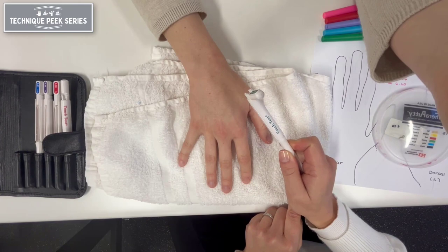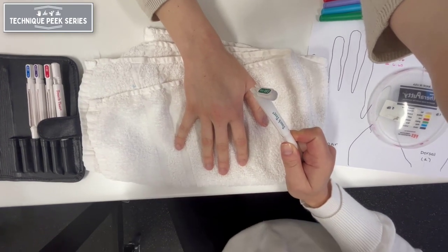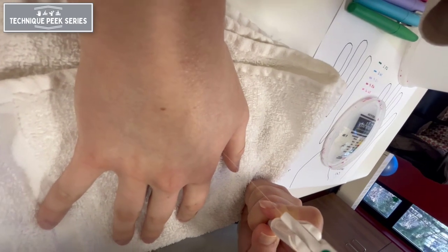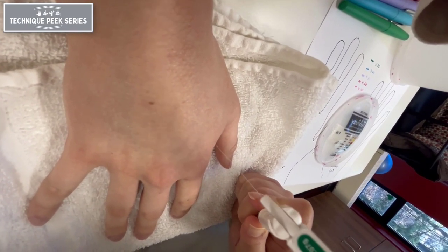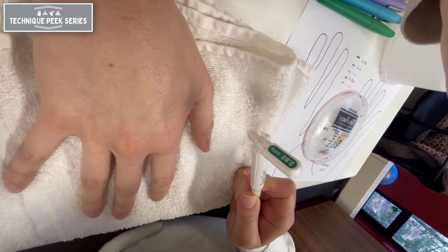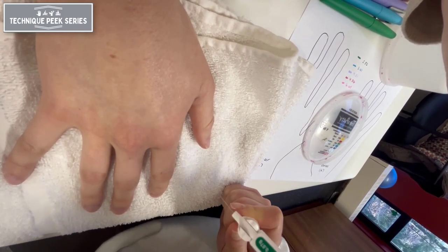It is not necessary to test every area of the skin when performing an evaluation. Checks may be done over areas innervated by different nerves. For example, in this case we are going to test an area covered by the radial nerve — the dorsal radial aspect of the hand.